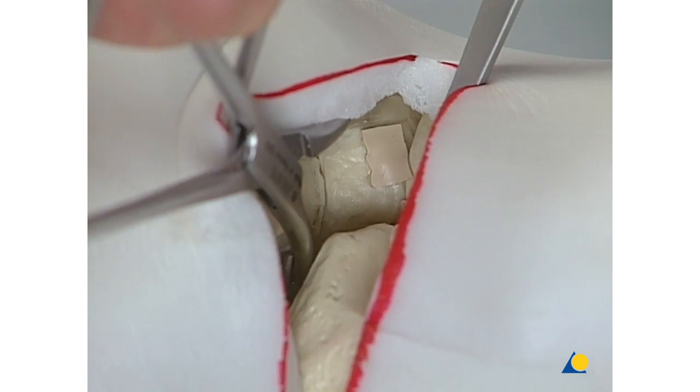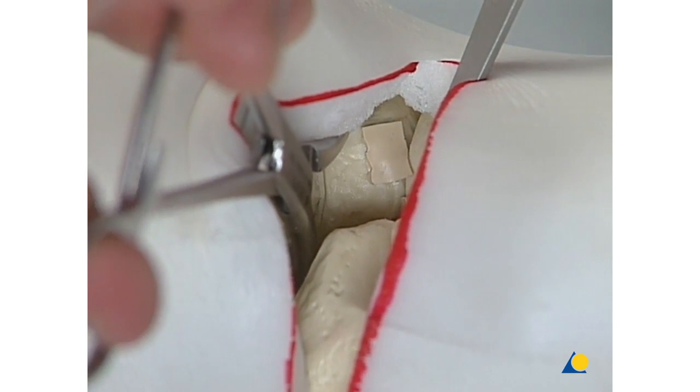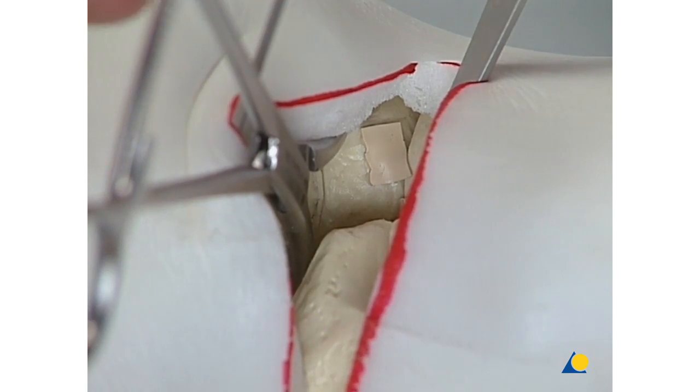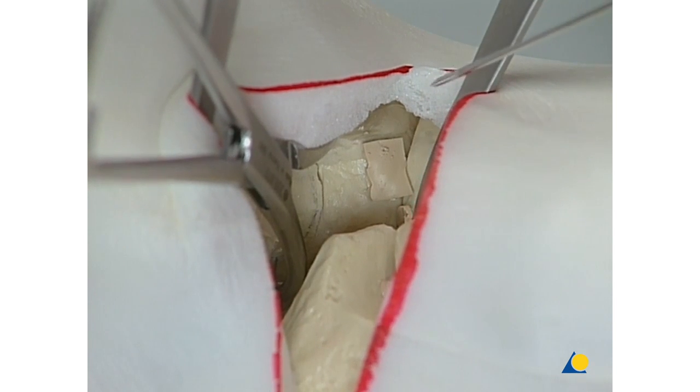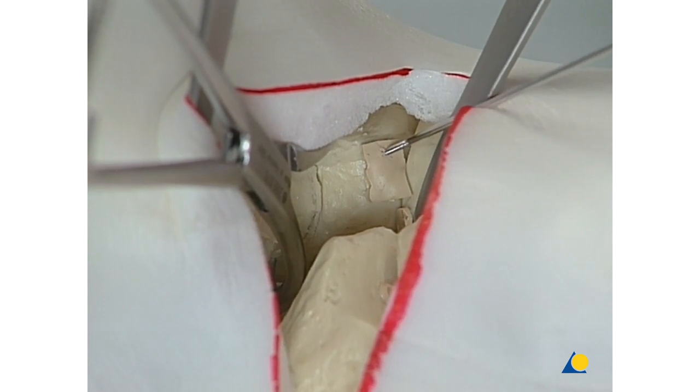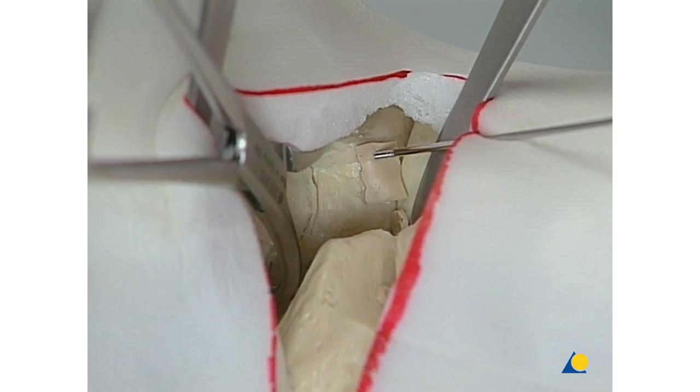Reduce the lateral aspect of the fracture using the small reduction forceps. Transfixion of the fracture using a threaded 1.6mm K wire.